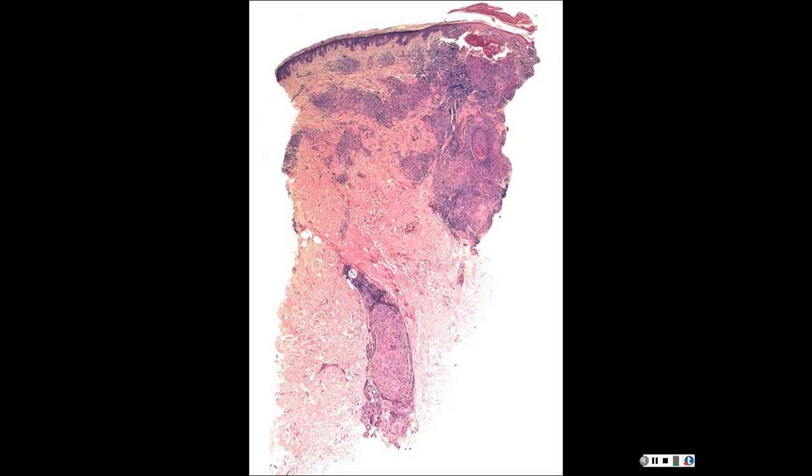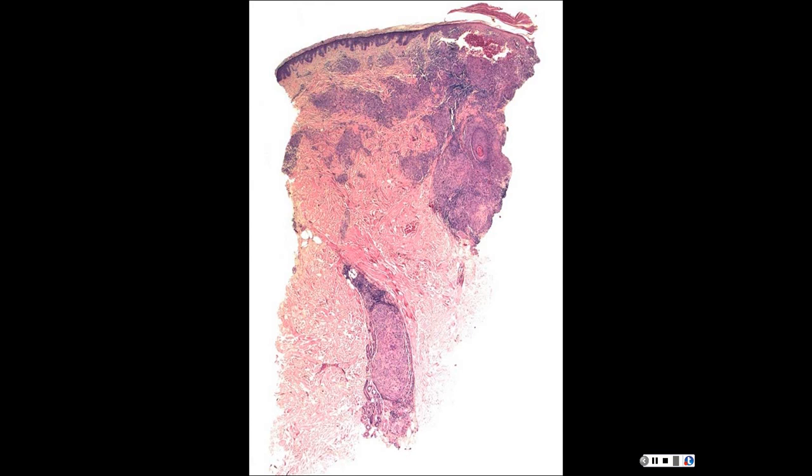Here's your path. So what do you think you're seeing in path? Kind of a surprise, right? Because that looks granulomatous, right? So then granulomatous things would include infectious granulomas, sarcoid, so TB, leprosy, all of those things, atypical mycobacteria.